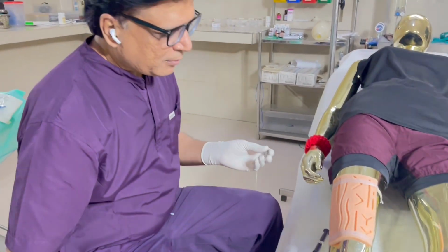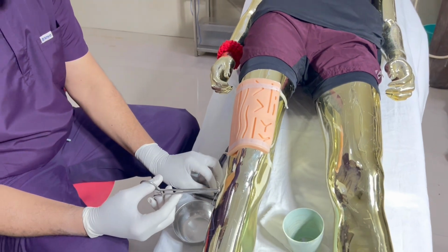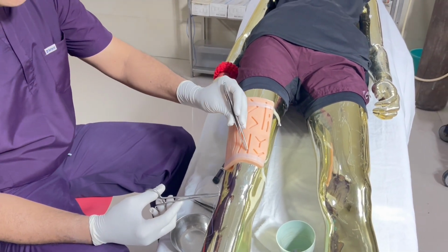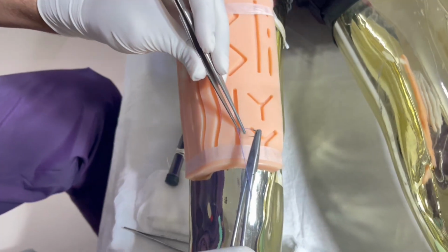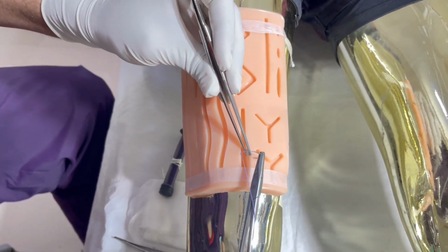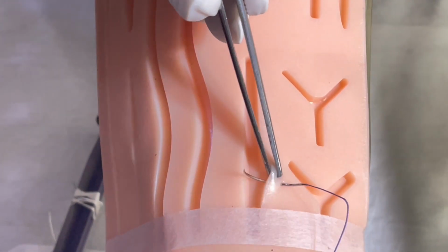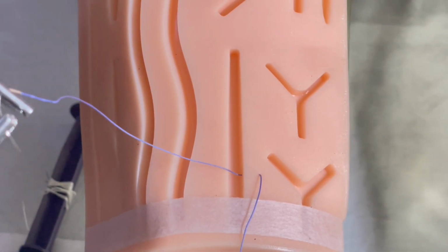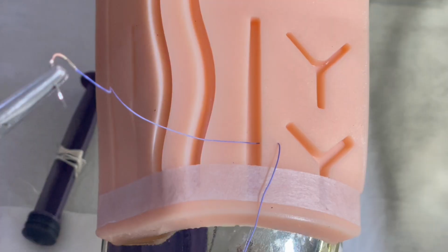So first of all, the vertical mattress suture. Initially, with this tooth forceps, it is better to catch the skin. Just put 4 to 5 millimeter on the opposite side, then take it out. To catch this needle with the forceps, it will be easier with a plain forceps.